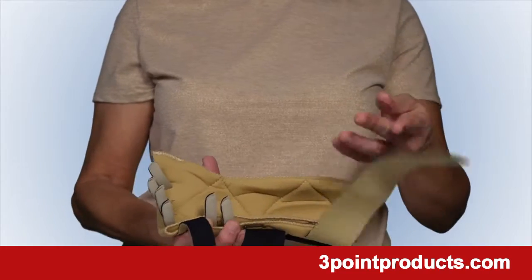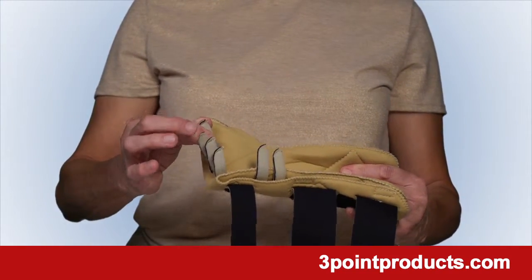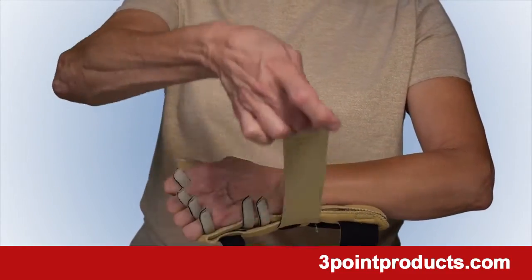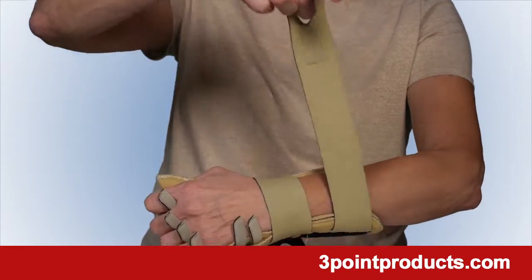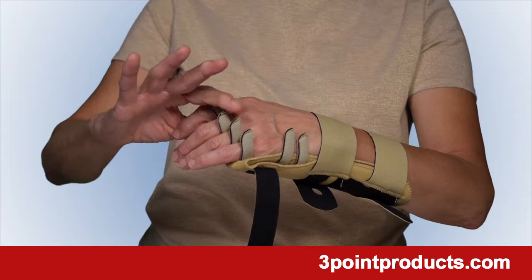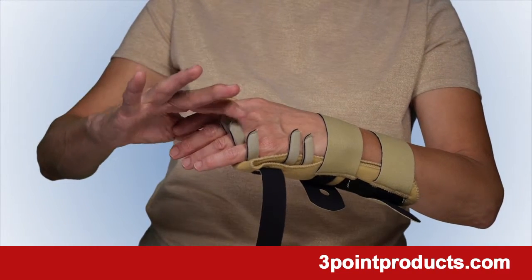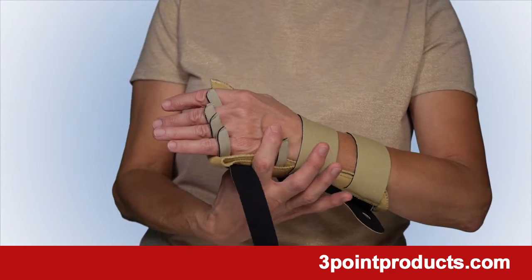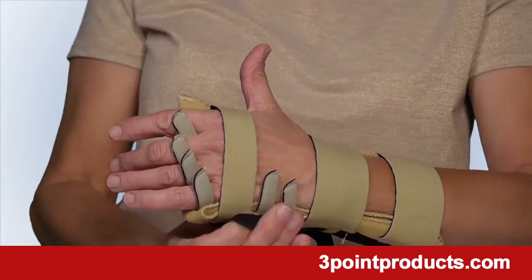Open the straps and gently open the finger pieces. Slide your hand into the splint and pull the straps around your wrist and then around your forearm. Gently contour the finger stays around your fingers to position them straight. Do the same with the stay over the back of your hand. Now put the strap on over the top of your fingers.